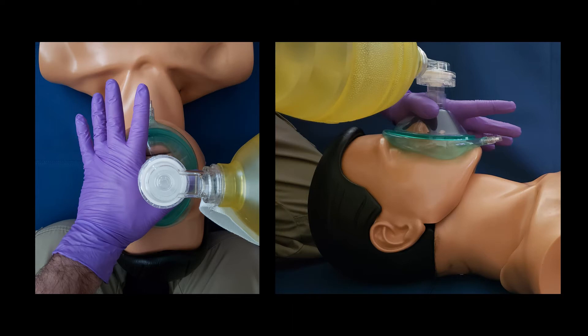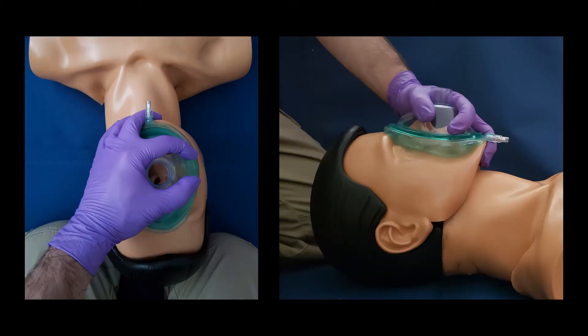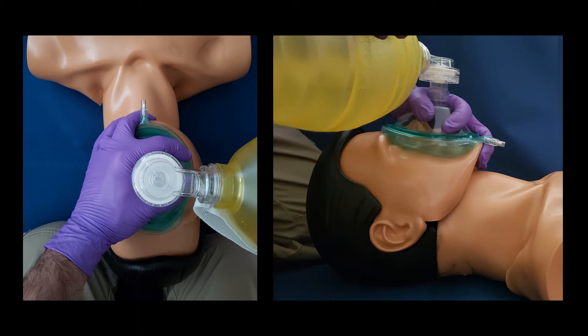Pictured here is the initial positioning of the thumb with the bag attached to the mask. The bag has again been removed to give an unobstructed view of the full EC clamp. The C is nice and high at the top of the mask and the tips of the three fingers are on the bony part of the jaw. Here we see the full EC clamp with the bag attached to the mask.